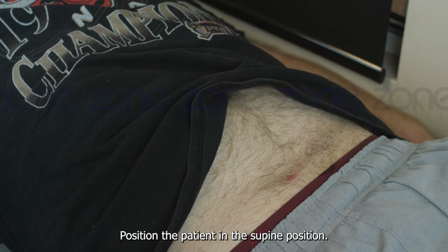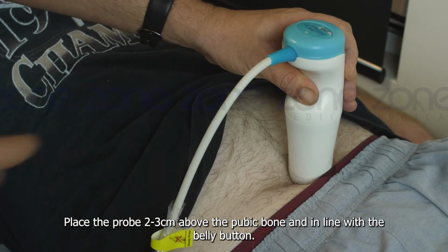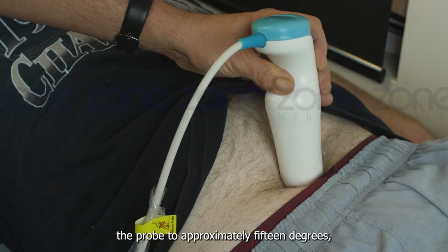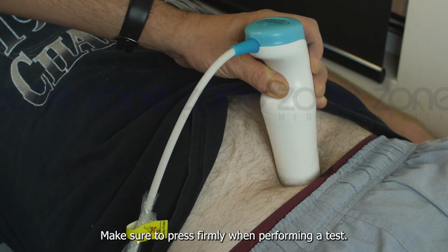Position the patient in the supine position. Place the probe 2 to 3 centimeters above the pubic bone and in line with the belly button. Once in the right position, angle the probe to approximately 15 degrees, or until you get a good view of the bladder, and press the scan button. Make sure to press firmly when performing a test.